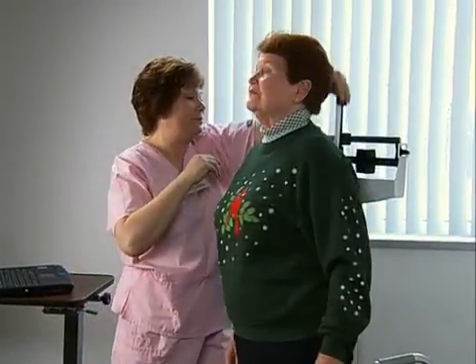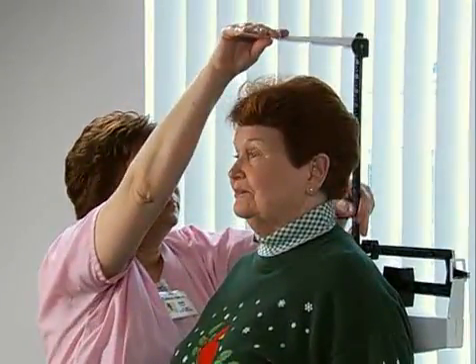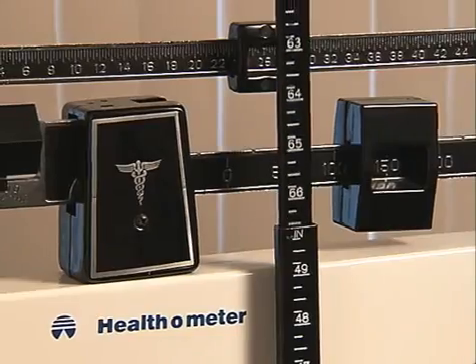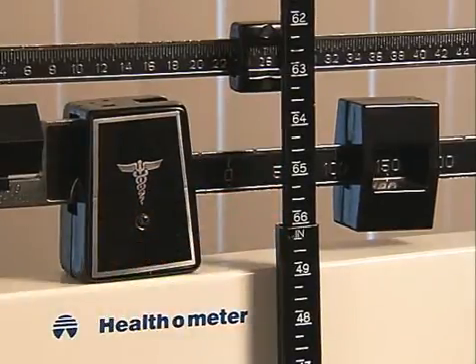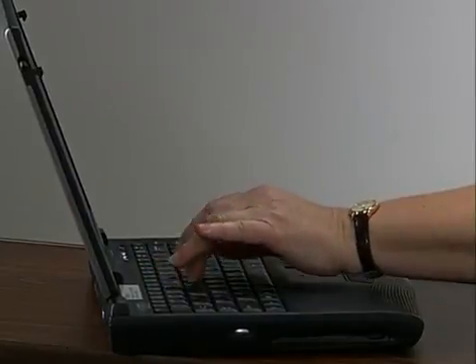Raise the measuring rod until it is higher than the patient's head. Fold the movable part of the rod at a 90-degree angle. Slide the movable rod down slowly until it touches the crown of the patient's head and observe the height on the measuring rod. After assisting the patient off the scale, note her height according to facility policy.